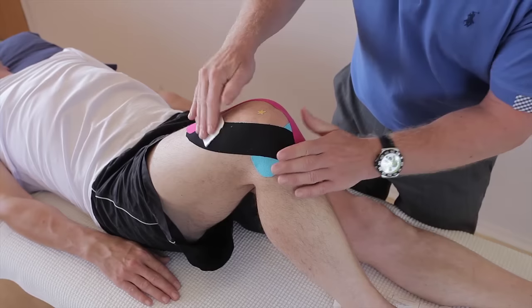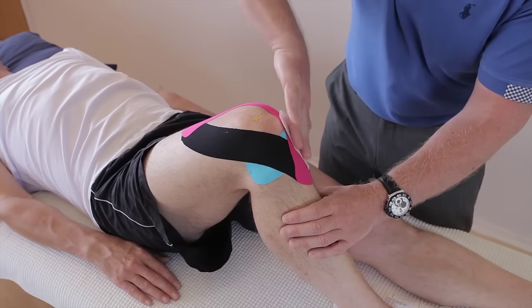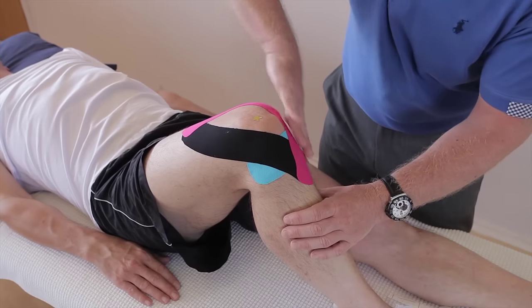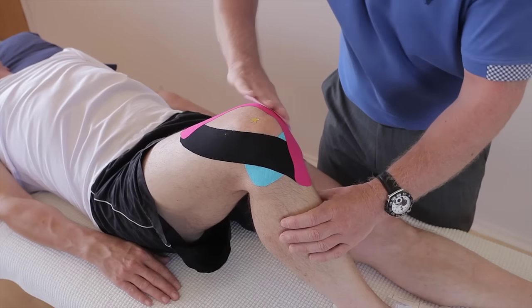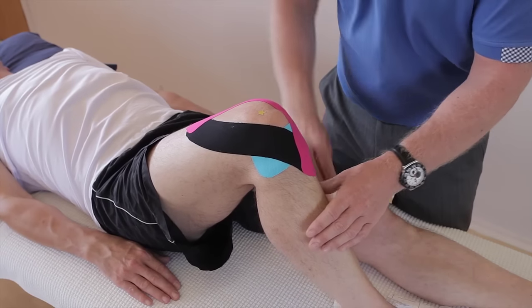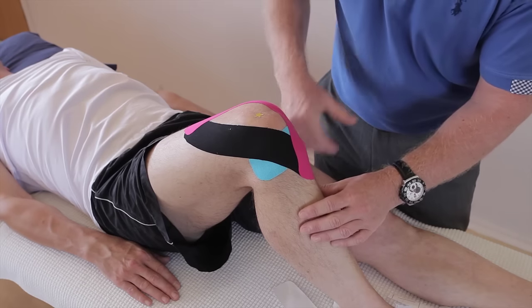Using the back of the tape, just to heat activate the glue. And there we have a full knee taping for patellofemoral syndrome and also for inferior knee pain.